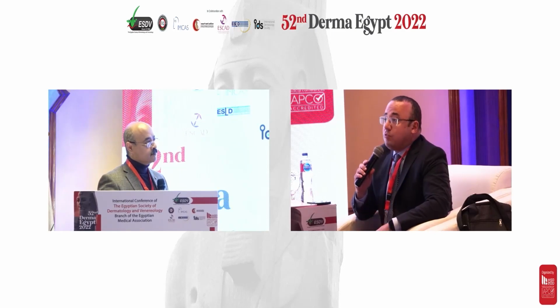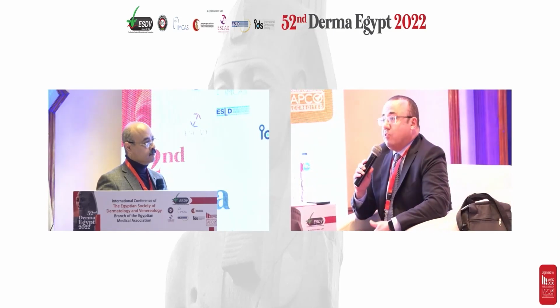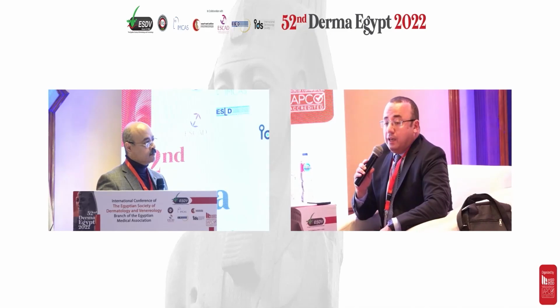So for melasma, as Professor Abir mentioned, yes, laser doesn't come in the first place, and if you're going to use laser, this will be a Q-switch laser. If someone has a pico laser, definitely. And the technique, again, you have to choose the proper wavelength and the proper fluence and a good technique in order to be able to cover the whole lesion in the best manner.